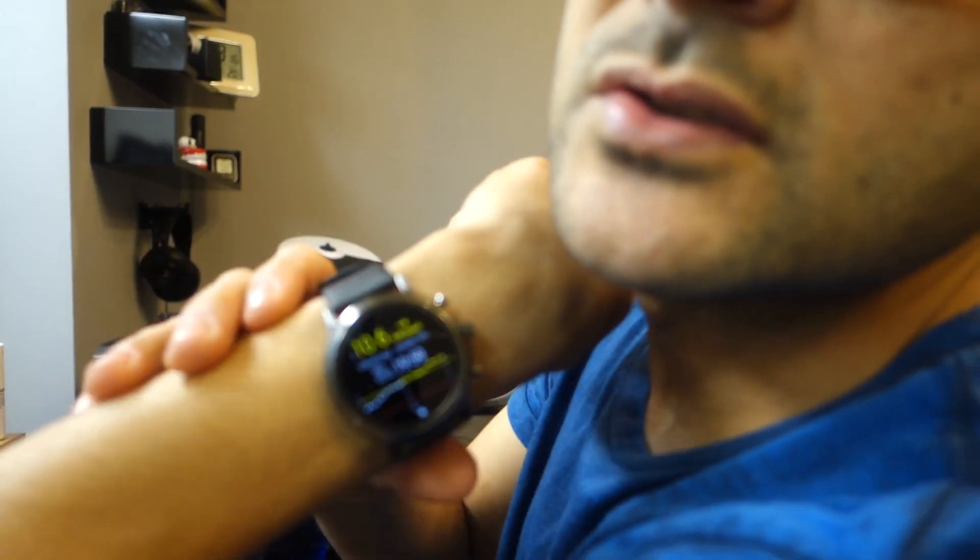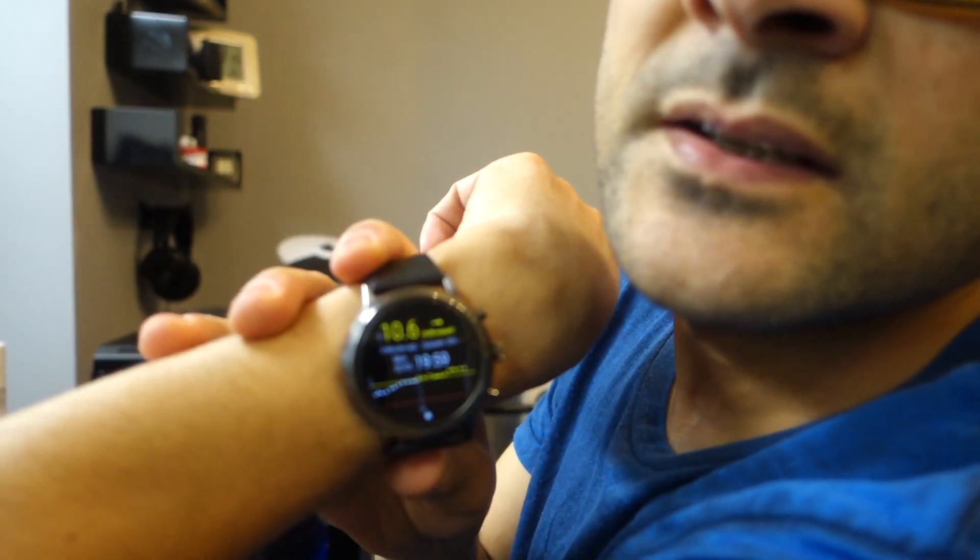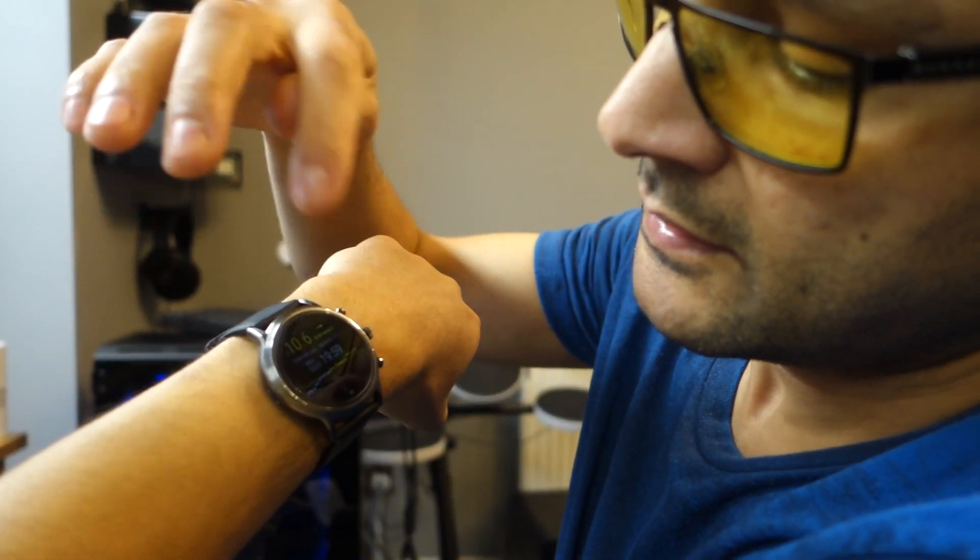That's my watch — so this is the watch and it's saying 10.6 at the minute. That's the reading coming from the phone.